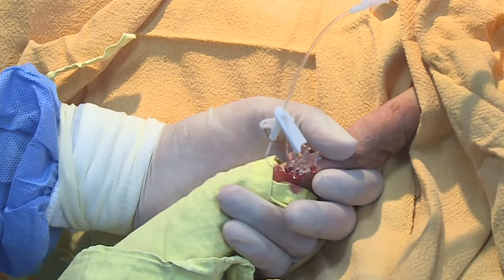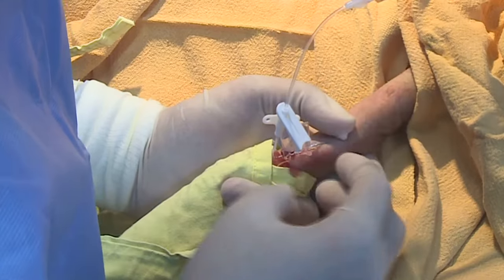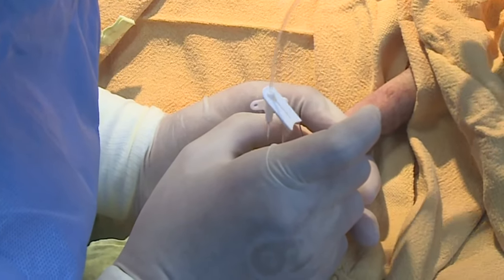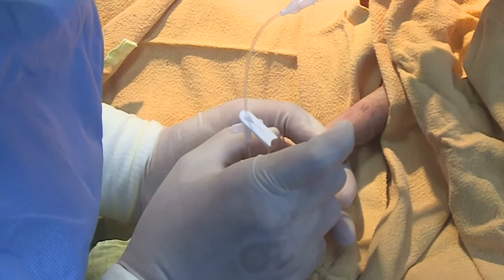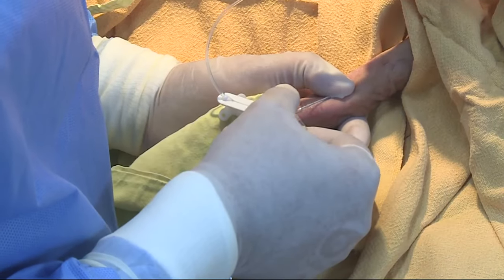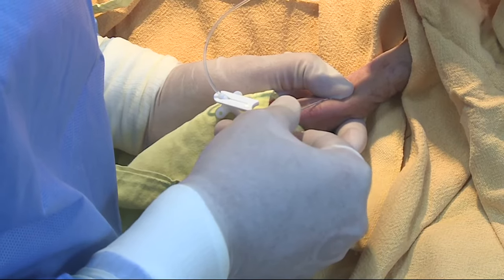If this fails, try holding the limb in a different position or flushing the line slowly using a 5 ml syringe. For a 28 gauge PICC, withdraw the needle over the catheter, and only when it is removed, apply gentle pressure to the exit site to stop bleeding. This may take 10 minutes or longer. Split the needle and lift the catheter out of the partially split needle.